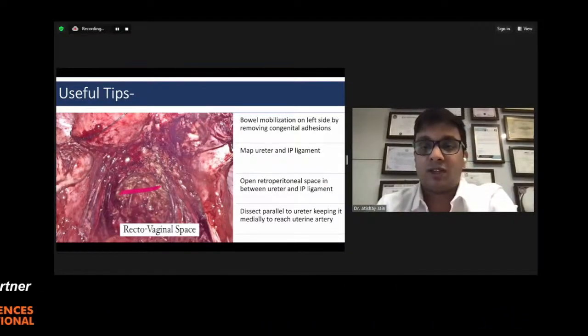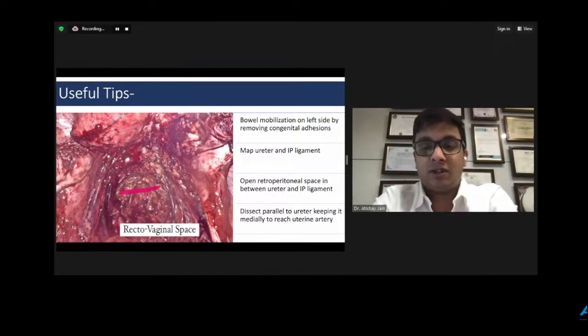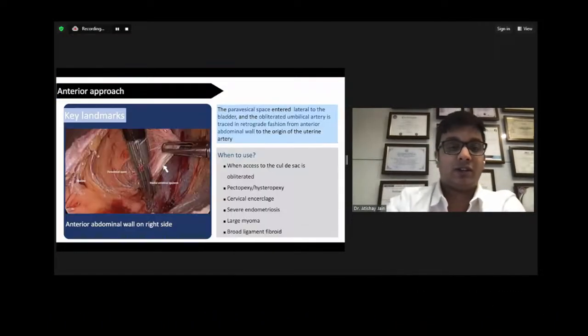Now, useful tips are the bowel mobilization on the left side by removing the congenital adhesions, mapping the ureter and the IP ligament. Open the retroperitoneal space in between the ureter and the IP ligament, and dissect parallel to the ureter, keeping an eye on it.